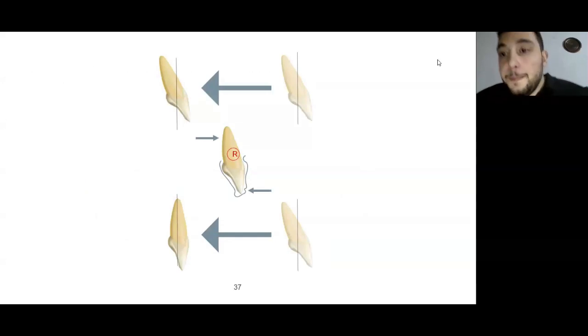Okay, so by now we have some theoretical understanding of the biomechanics of clear aligners. I just want us to take this practical example in order to have a deeper understanding of what we might face when we start actually moving teeth. So let's take the simplest movement possible. Let's assume that I want to move the central incisor, and I want bodily movement on it. I want it to maintain the same torque, the same angulation for the root and the crown, and I want to apply force with a clear aligner.